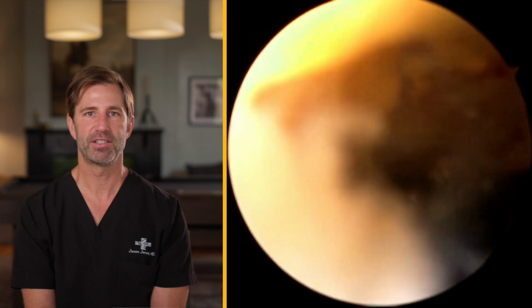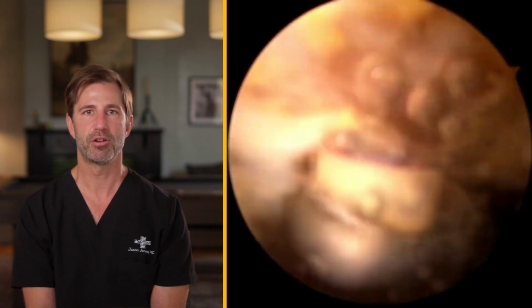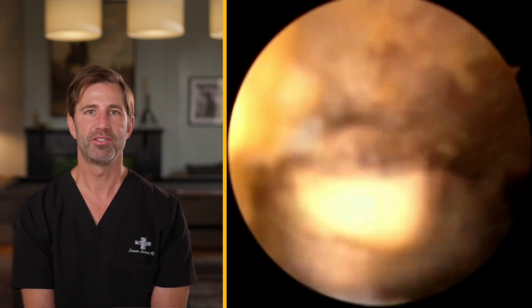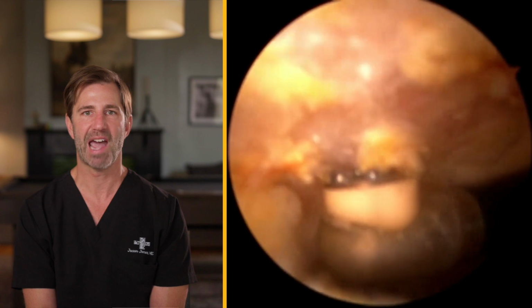At this portion of the case, we've inserted the camera over top of the rotator cuff. What you see above us is the undersurface of the acromion. The acromion is the bone that you can feel on the top of your shoulder, and this is a portion of the larger bone called the scapula.